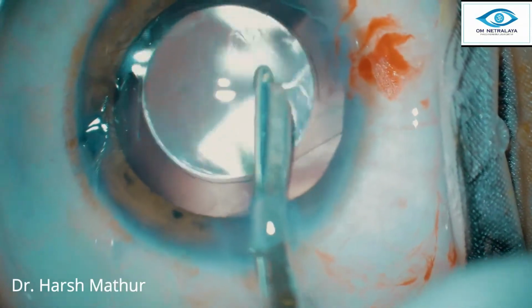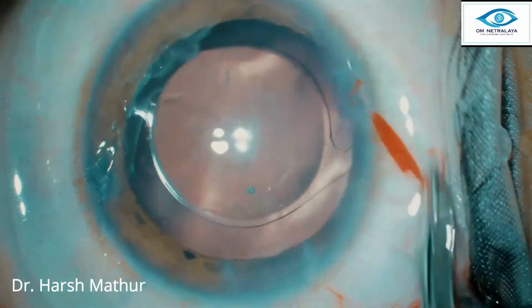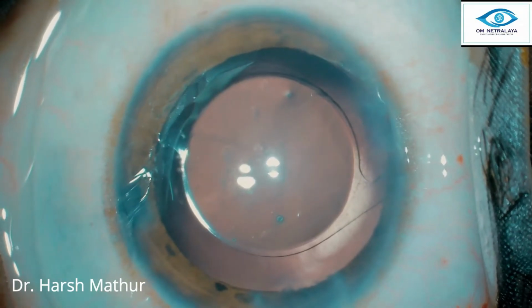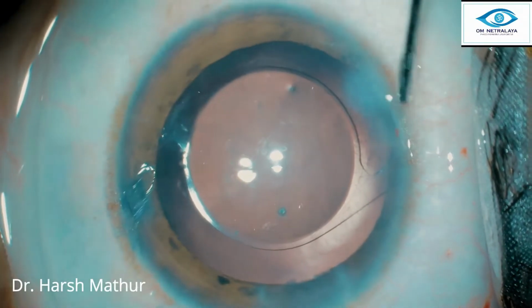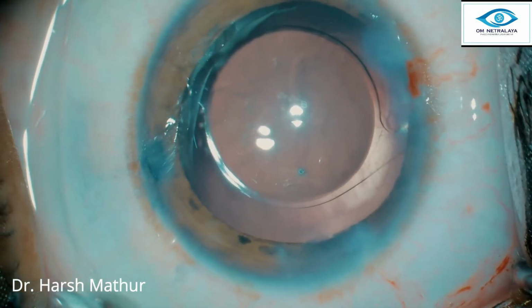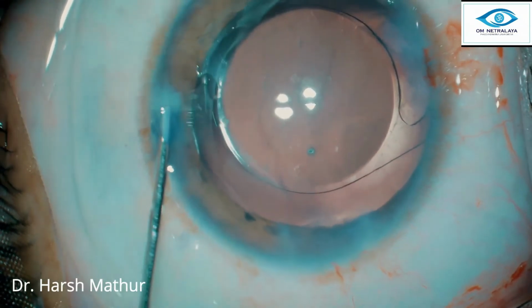So the take-home message is, soft cataracts are the hardest to conquer. So we need to find a way to deal with the nucleus which is safe and repeatable. So I find bringing out the nucleus is the best way. So either by hydrodissection we are able to take the whole nucleus out of the bag, or tilt the nucleus and bring one pole out of the bag, or hydrodelineate and bring out the endonucleus out of the bag.